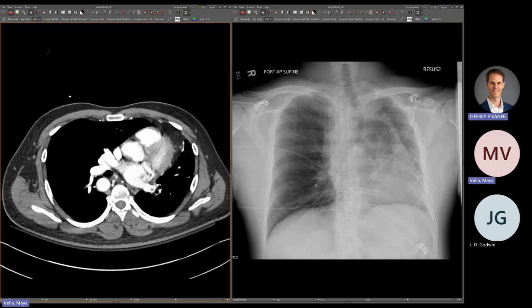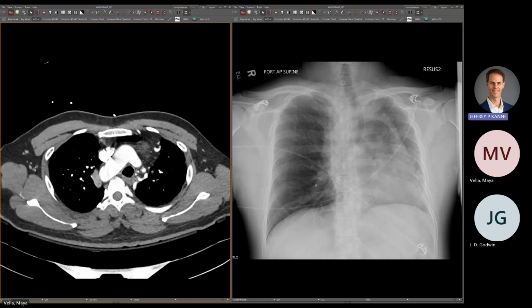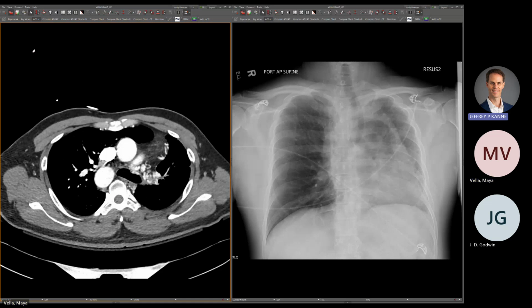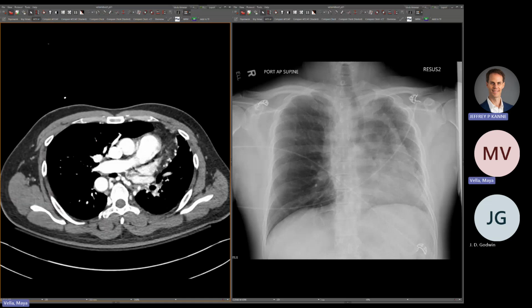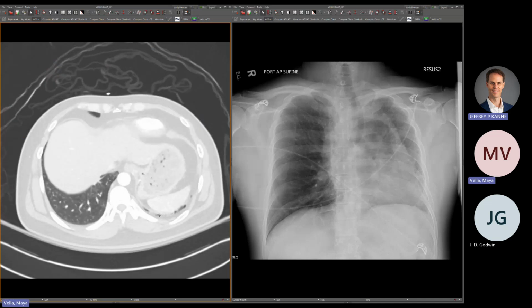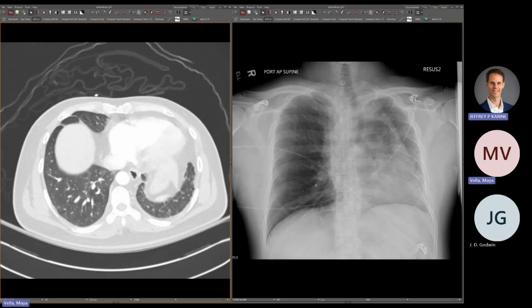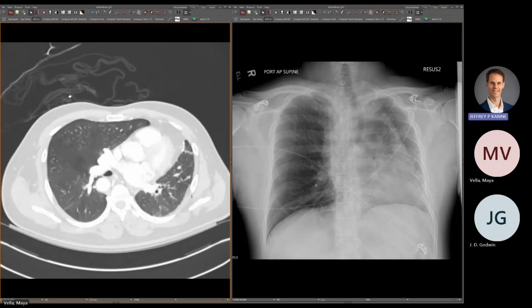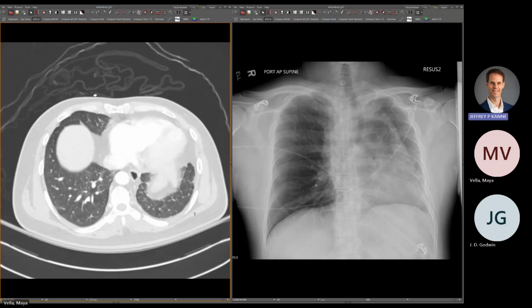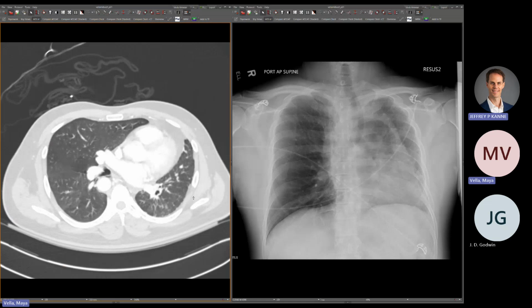Yeah, you know, it's interesting. I've looked at a few of our cases of this, and usually the lung is small, but I've seen some that are normal otherwise, and I've seen some that have weird cysts in them or weird emphysema-like looking spaces. So I guess I don't know why that happens, but probably abnormal development. Yours has impressive systemic supply, though. I've not seen one that impressive before.